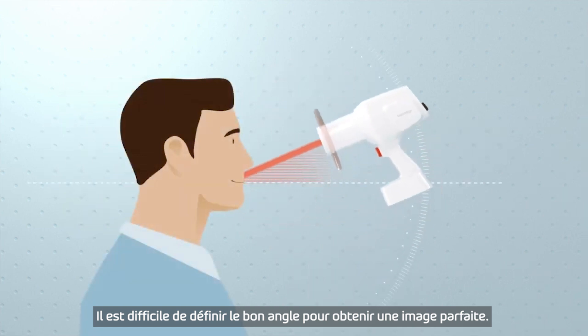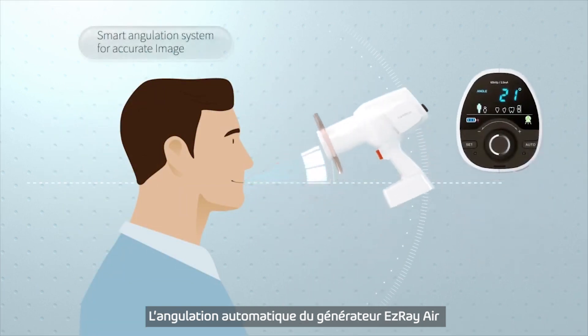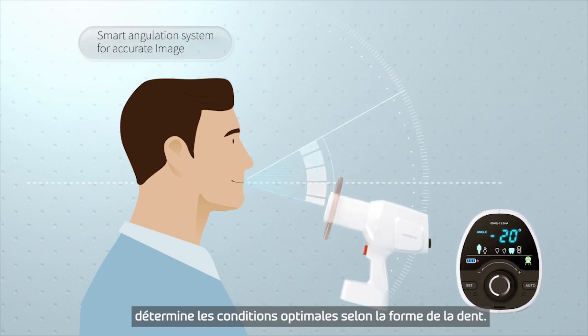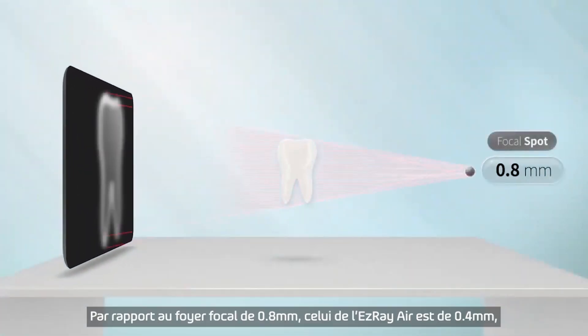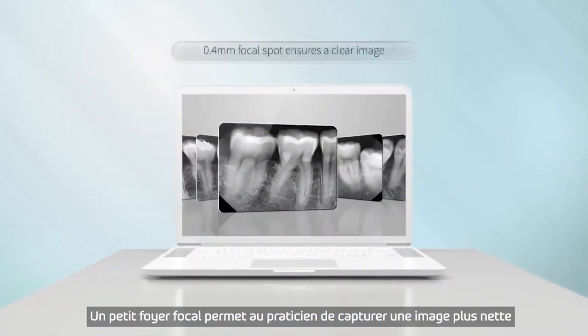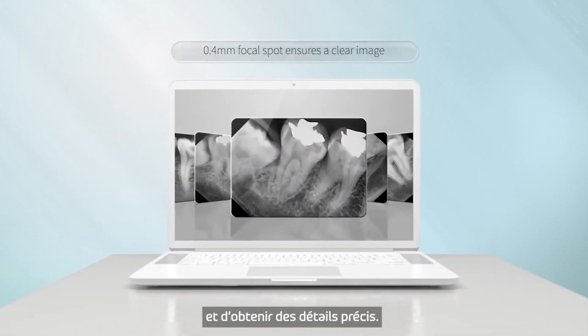It's not easy to fit the right angle to produce a perfect image. Smart angulation of EasyRay Air automatically sets optimal conditions according to the shape of tooth type. In comparison to the 0.8mm focal spot, the 0.4mm focal spot ensures a clear image. A small focal spot allows operators to capture a clear image and obtain specific details.